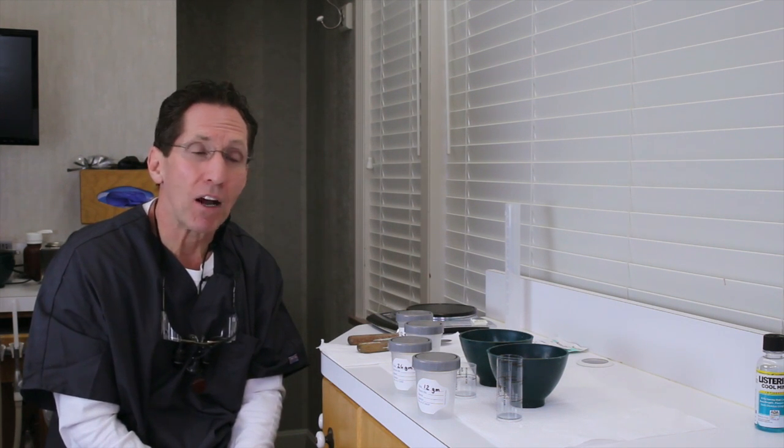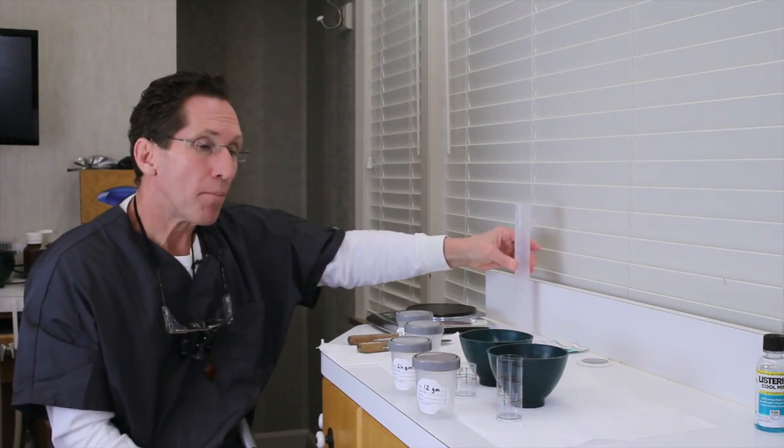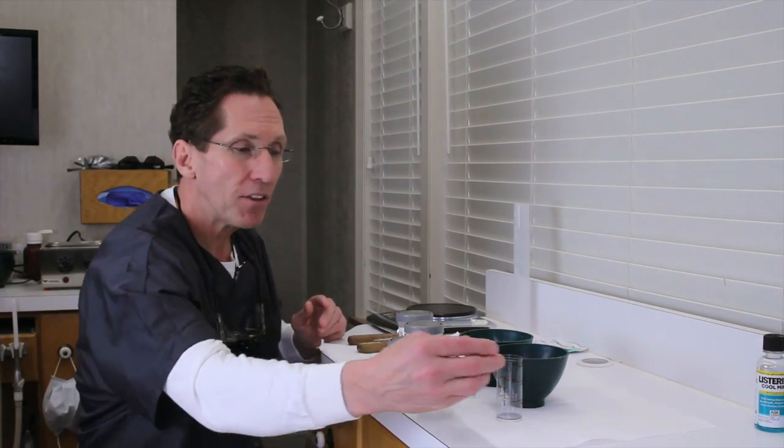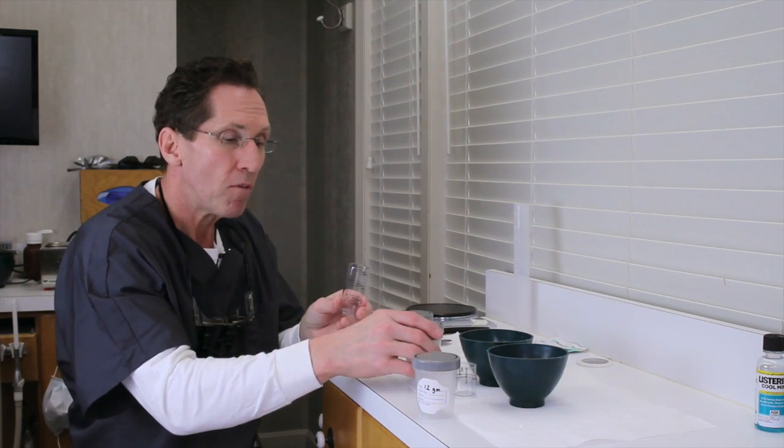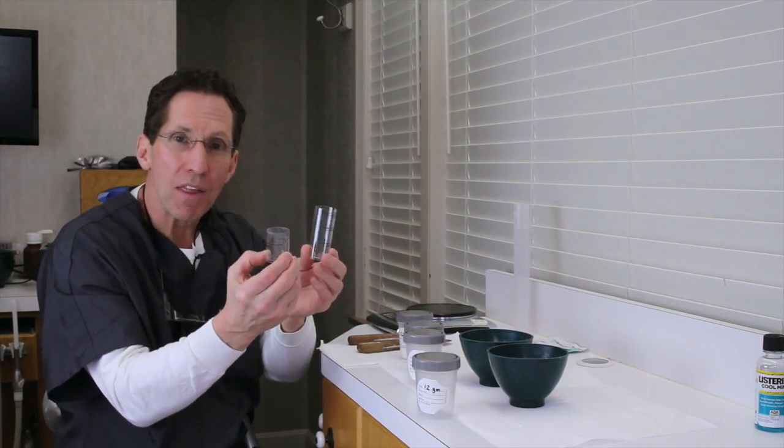If you rely on the volume of powder measurement, which is what's recommended on the Gel-Trate can, you're going to have very inconsistent measurements. You're going to find if you were to scoop them out and have 2 different assistants doing it and over different times, you'd be very surprised at how much variation you're going to have in the actual amount of alginate there. Now, from the water standpoint, again, we determined that and measured this. What I did to make it even easier, I took these water measures, these water scoops, and to make it as easy as possible, I have pre-cut these to exactly the amounts we want.